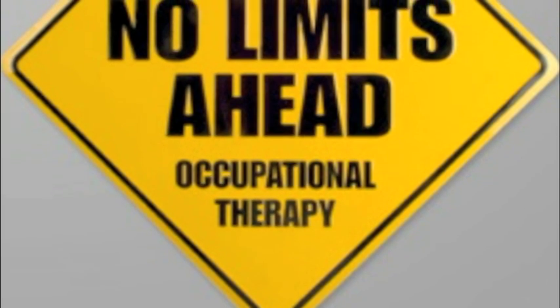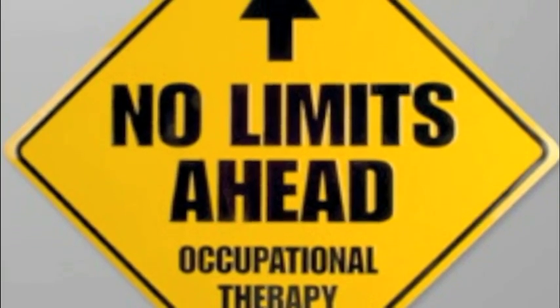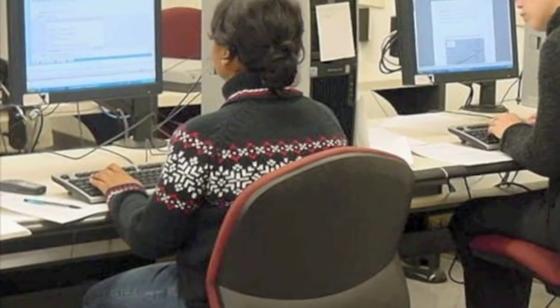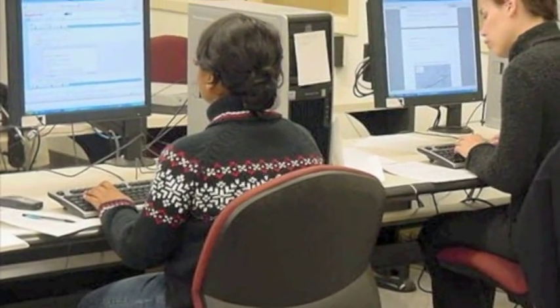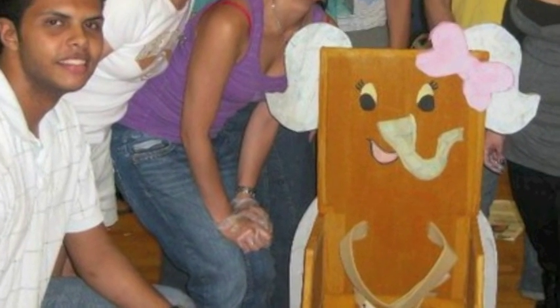The core of occupational therapy revolves around engagement in meaningful activity to help support an individual's mental and physical well-being. The computer has become an important influence on an individual's daily life by creating new ways for individuals to communicate, get an education, participate in leisure activities, and much more. Individuals with a disability may need special devices or adjustments to be able to efficiently use the computer.